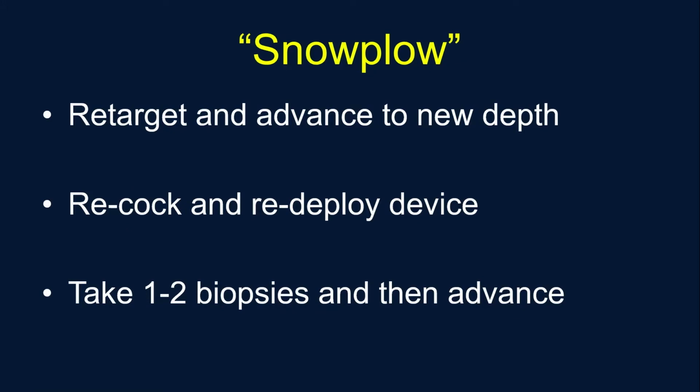You can try to retarget and advance and push the needle in further to get to the new depth, but I found that sometimes in that very dense tissue, you advance and then you're going to recock and redeploy, and you may have to do that several times to make progress to tunnel through that dense tissue.